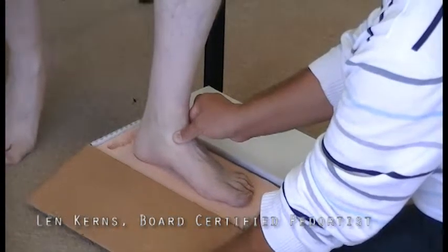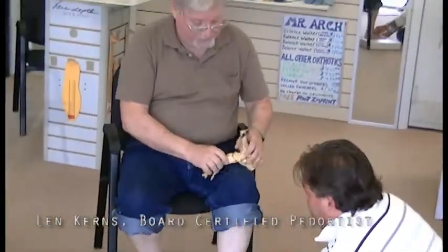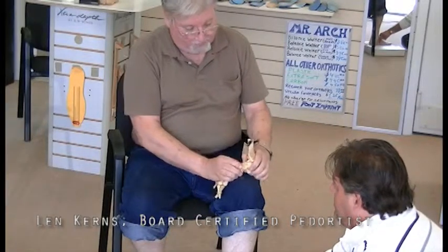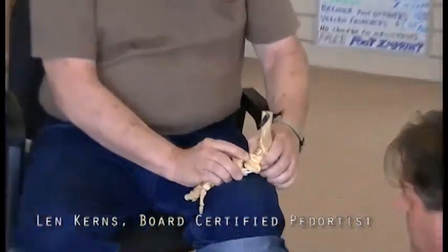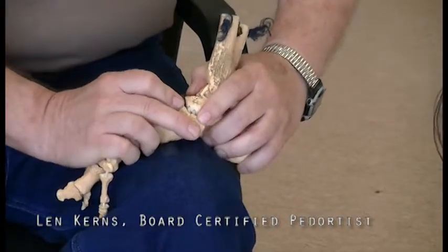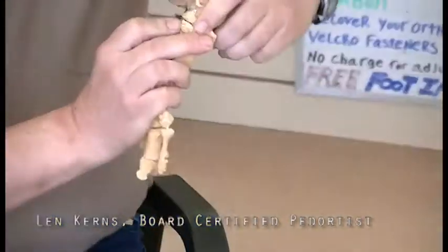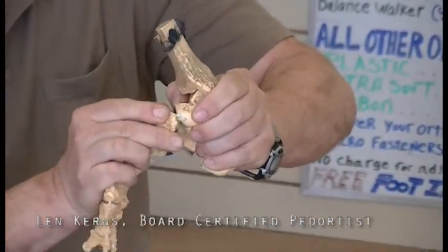This is George. He didn't pay me for an orthotic, so I cut his foot off. But as you can see, it's a right foot, and he has his thumb right here in this inner space. As the foot falls down, the navicular bone tends to fall in, and he's feeling that with his thumb over here. And as he brings the foot back to neutral, these lock in place, and that's neutral. Now, if he goes too far, then the talus sticks out against his thumb.